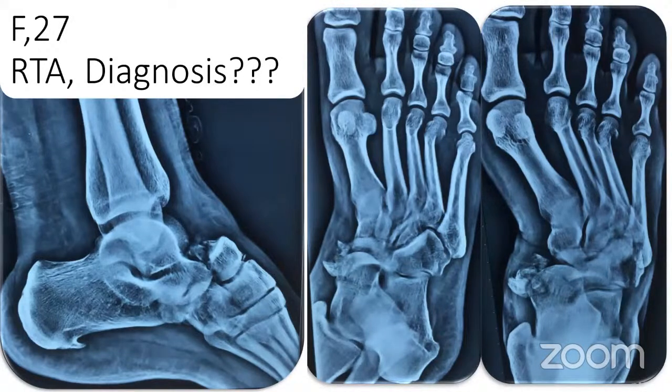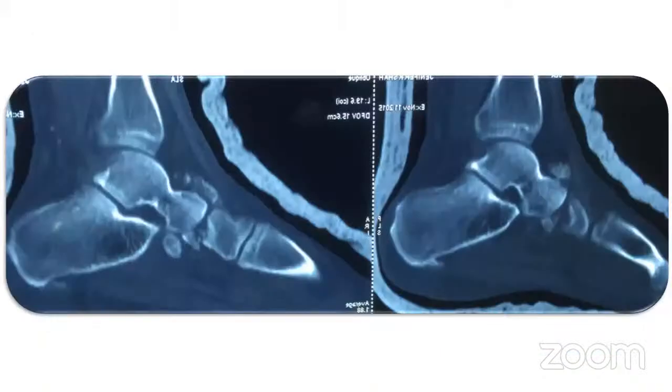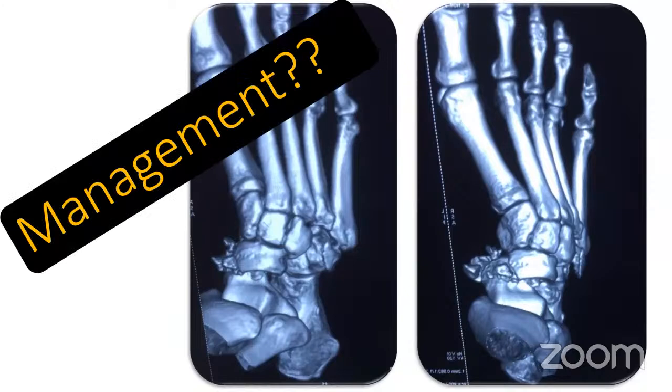And anything on the metatarsal neck side? Base of the fifth and fourth. Second, fourth and fifth. Third and fourth, and neck of fourth. Neck of second, third, fourth. Sorry, second, third. So this is how the CT scan showed the comminution. Again, this was the 3D CT.